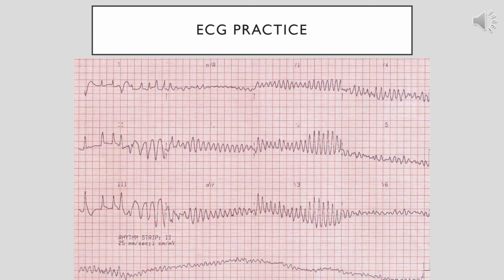And it's just chaotic. So this patient needs shock therapy as soon as possible, and they probably are undergoing ACLS measures with CPR and everything.